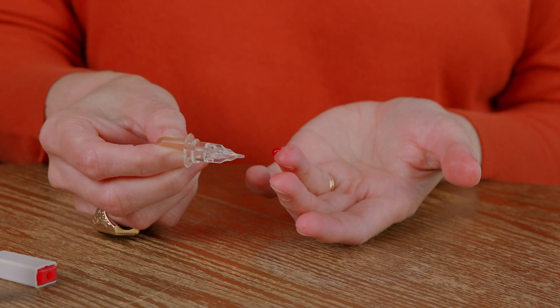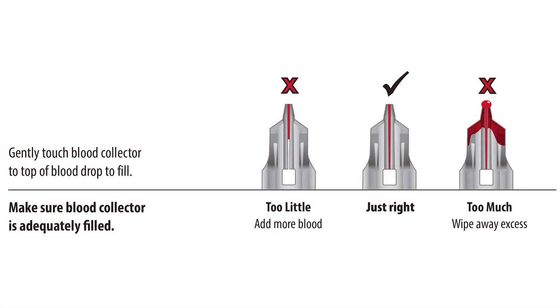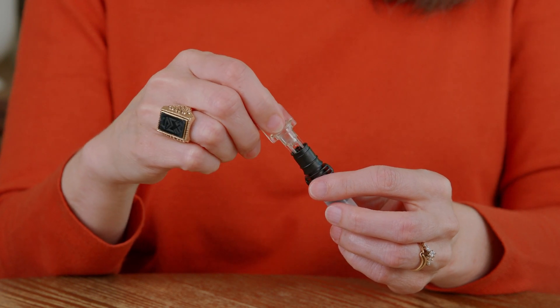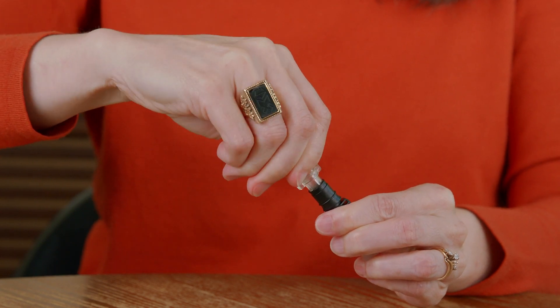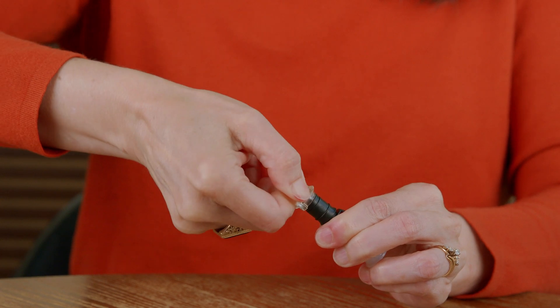Next, take the blood collector and gently touch the blood drop with the tip of the collector to fill. The blood will automatically be drawn into the collector. Be sure you fill it completely as shown here. Now I see that I have enough blood collected to perform my A1C test. Then you will fully insert the blood collector into the shaker body.